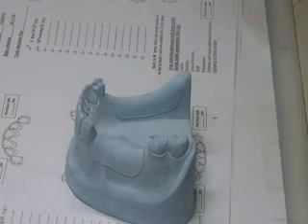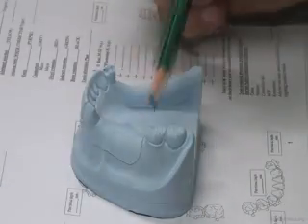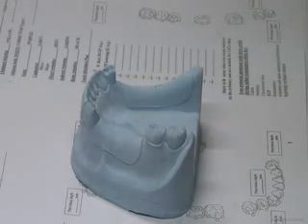Okay. Let's move on now to the case. We're still on the left, we're on the upper. Where is the junction between the upper and the lower? This is the junction. We are left with the basic design. We said major connector. The best major connector in the lower is? Lingual bar is the best. In upper, what is the best major connector?